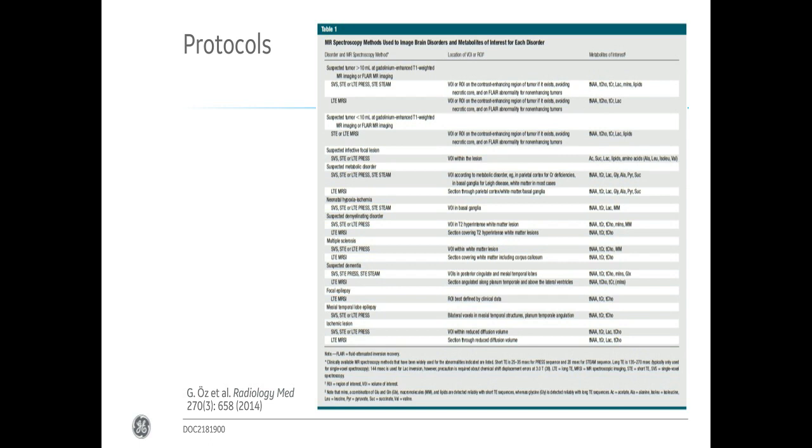It's in this presentation most probably too small, but you really should write down this reference and look into this paper, which also lists the metabolites that are important for each application. So it's really a great reference, and it's the first paper that this consensus group tries to bring out to push again the clinical use of spectroscopy. As I said, it focused on clinical spectroscopy in the brain.